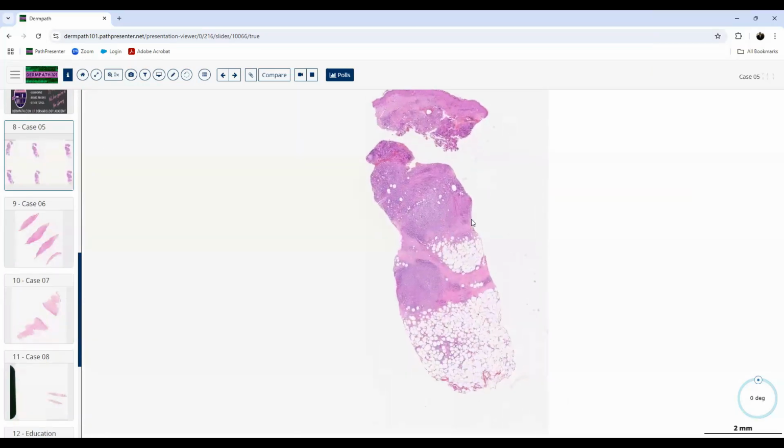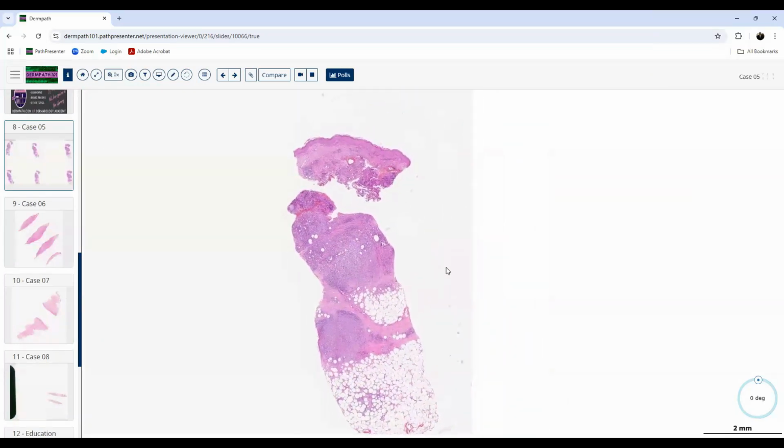All right, I can take this one. Good. It looks like we have a pretty deep punch here. And there also seems to be inflammation pretty diffusely, like inflammation deep in the subcutaneous area. Just looking at it, it looks benign. It doesn't look like a neoplastic process. Good. So you think it's inflammatory? Yes, I do think it's inflammatory.